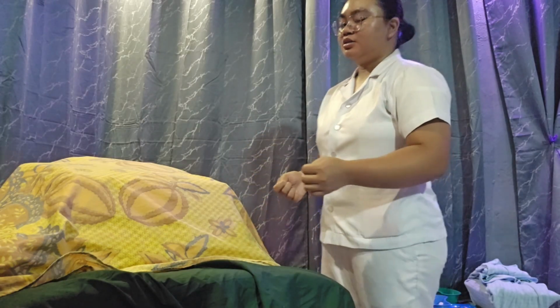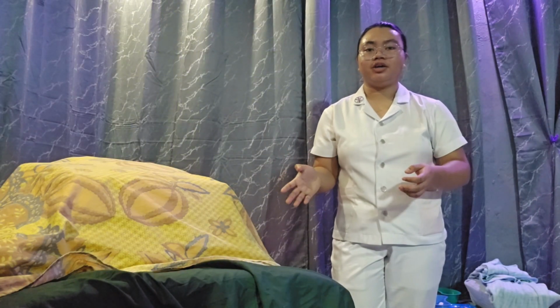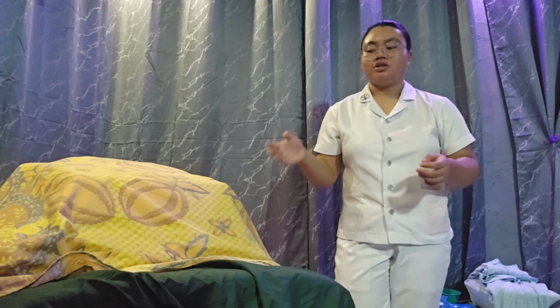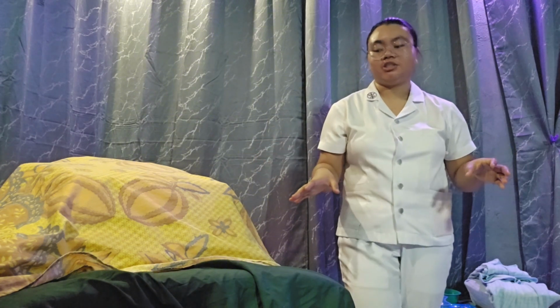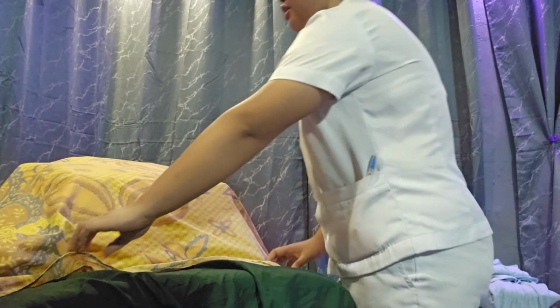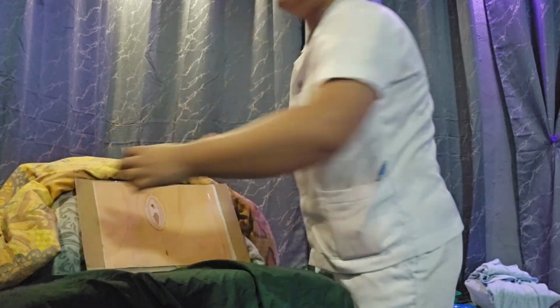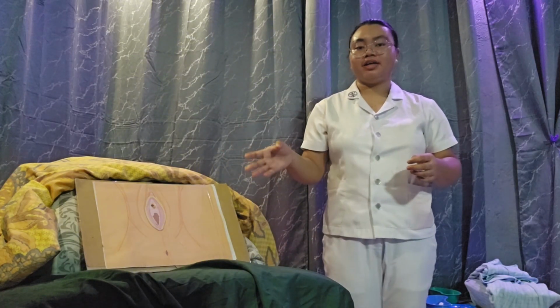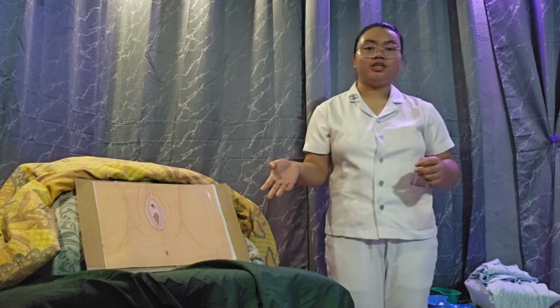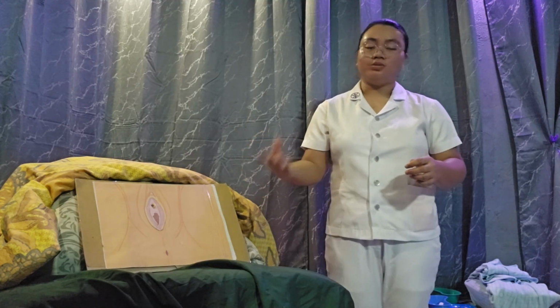Okay? So after positioning the patient, we're now going to drape the patient, exposing only the area to be used. So this would ensure that the patient will remain comfortable, as well as to avoid too much exposure for the patient. So ma'am, I'm going to expose your genital area po, okay? And then after exposing the patient's genital area, we are now going to apply a direct light for visualization of the patient's genital area, and for us to easily locate the area to be used.